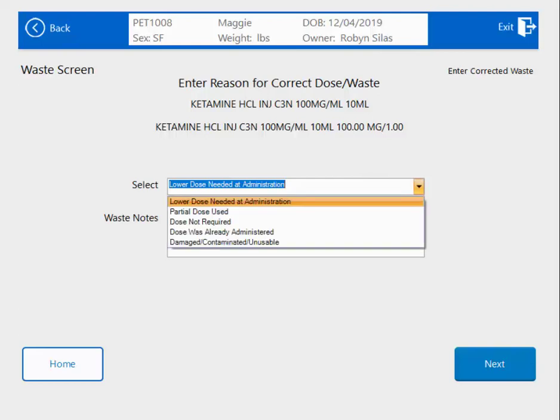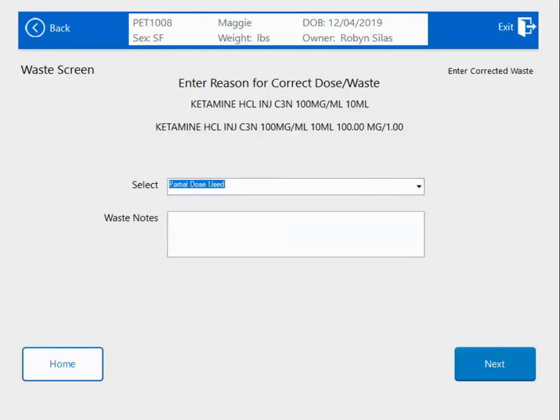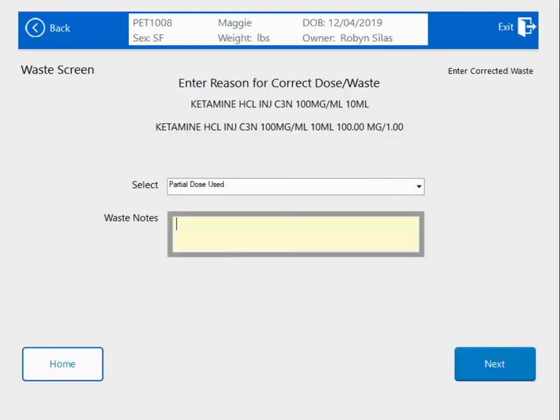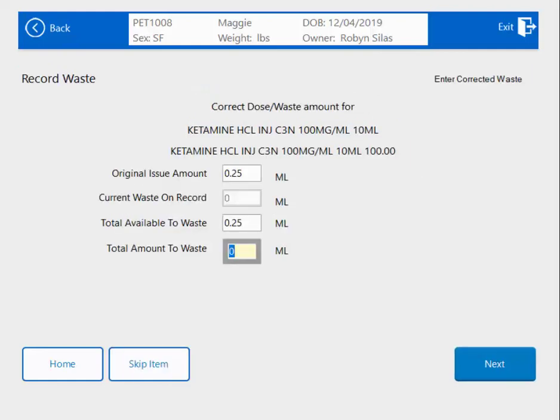Here is a drop-down of different standard canned responses for a waste. I'm going to choose Partial Dose Used, and now I'm going to take advantage of this free text field. When I hit Next, it's going to ask me how much of the original issue amount I'm going to be wasting. I originally issued out 0.25, and I'm going to be wasting 0.1.